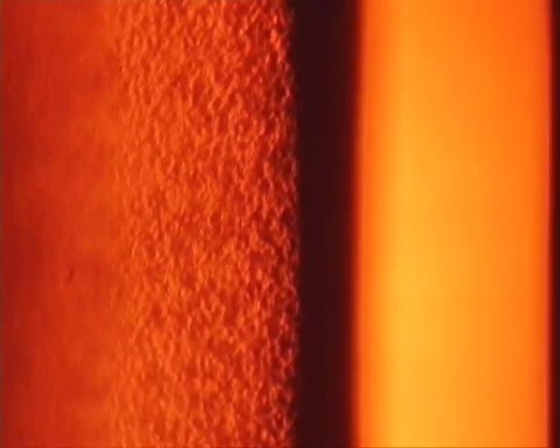If we widen the slit beam, we recognize the epithelial specular reflex with highly reflecting spots interspersed with dark areas here as well as here. In this next case, the pattern of the glistening spots is more irregular. In addition, there are numerous and much smaller reflecting dots. And here we see the corresponding phenomena in retroillumination.